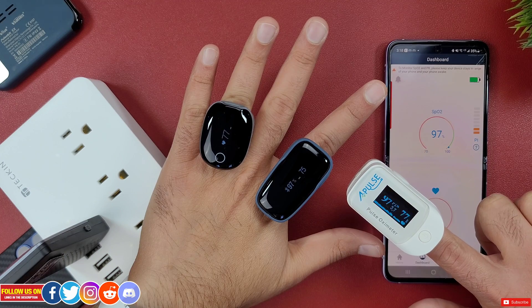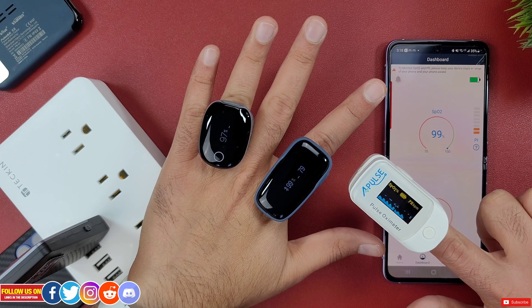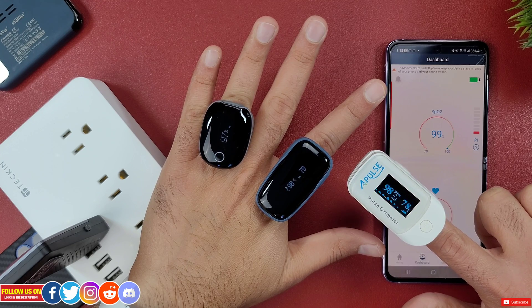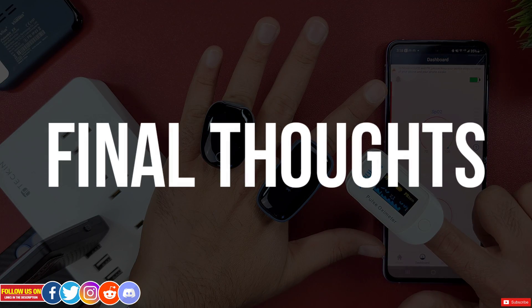Now let's test the OxaLink's readings against the O2 Ring and a finger oximeter. As you can see, all devices produce very close results.